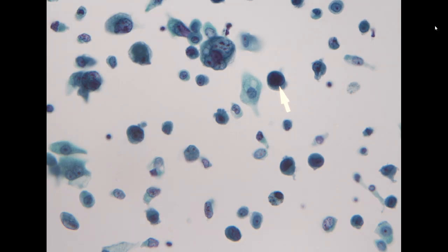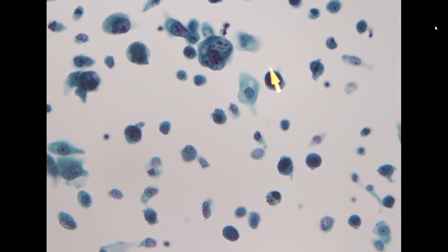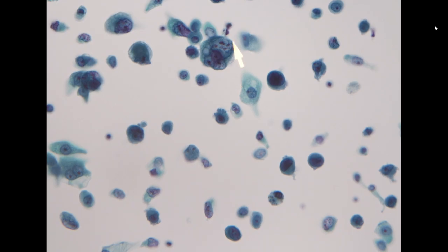So here you see very high NC ratio and hyperchromasia. Right next to it, there's an intermediate urothelial cell. So this is a very big contrast. You can see high-grade UC and benign urothelial cell. And this is definitely a positive cell. It looks very bizarre with multinucleation.